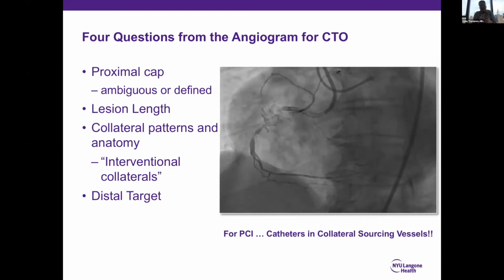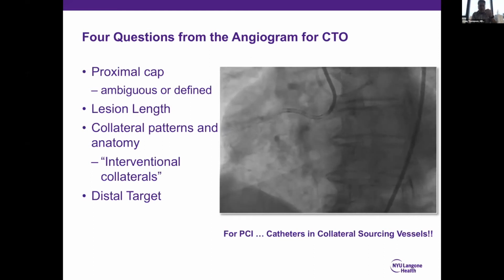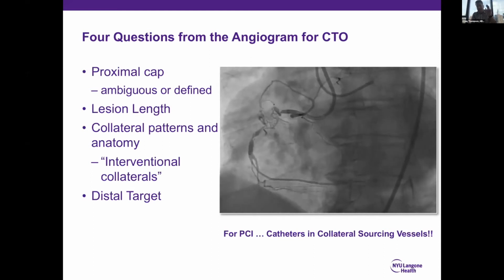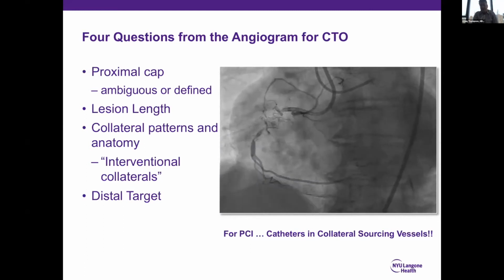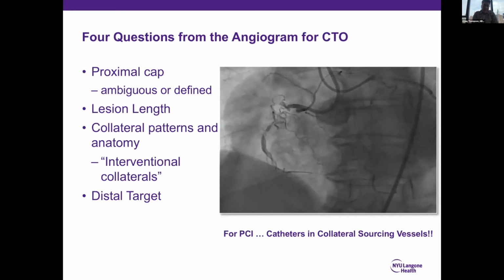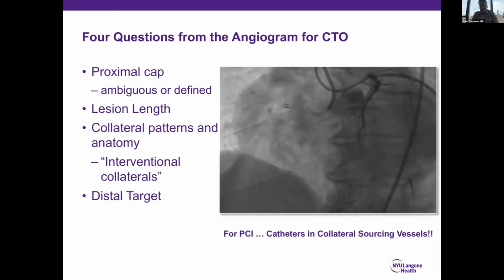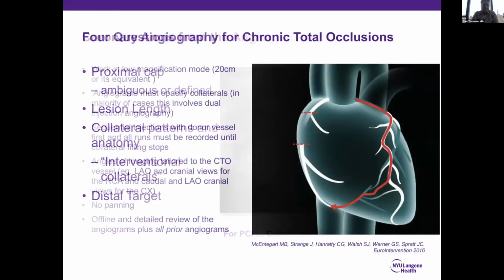So you'll find that during the course of these cases, one would be tempted here to say, oh, I'm just going to put in a single catheter, and we'll try to get a wire across and so forth. The moment you start with this lesion, you're going to lose visualization, particularly of this critical segment of the distal landing zone, to assure that your wires and devices are in a safe place and you're less likely to encounter complications. So this multiple catheter sourcing on the interventional side is incredibly important.